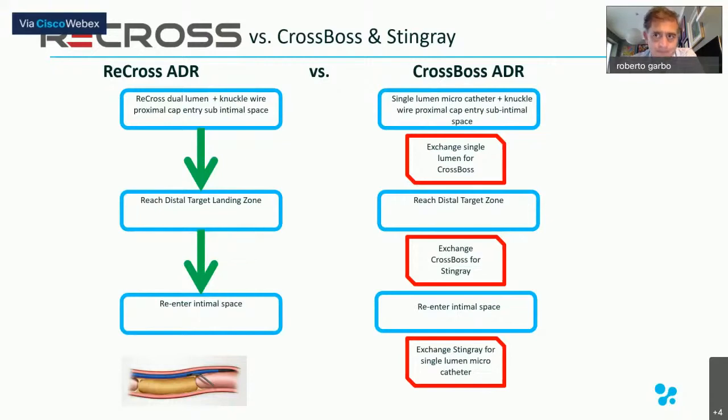This is an example of the versatility of the Recross device and how we can use it as a re-entry system. In this slide are explained the different steps that you should perform during the advancement when you perform the ADR using the CrossBoss and the Stingray.